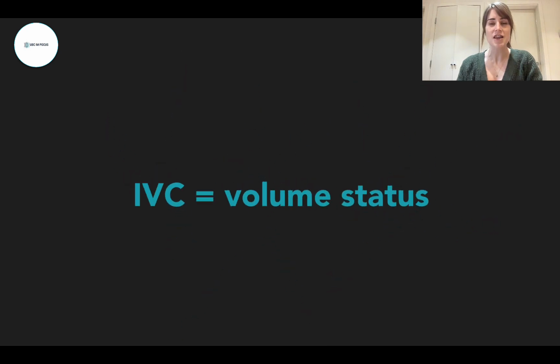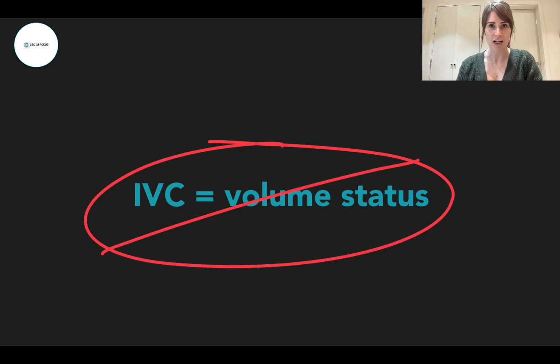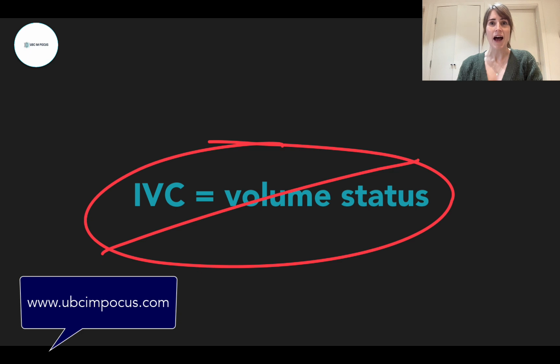So on that note, right off the bat, before we start, there is a very common misconception that the IVC will tell you the patient's volume status. And if you take nothing else away from this screencast, please understand the IVC is not a marker of volume status. Volume status is highly complex, and again, please check out that dedicated video. But the IVC, nor any single measure, cannot tell you a patient's volume status and cannot tell you whether or not you should give a patient fluid. It is one data point, and we're going to talk about how to properly acquire that data point and how to use it correctly, but it is not a single answer to some mythical volume status question.